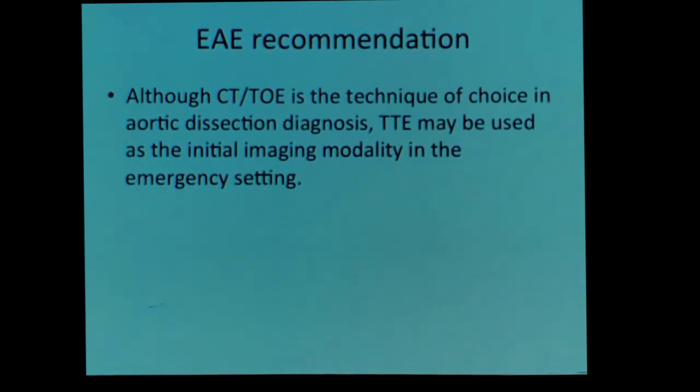So, although this is the European Association of Echo, and they seem to be more into transthoracic echo for dissection than Americans, they say, although CT or TEE is the technique of choice for aortic dissection diagnosis, transthoracic echo may be used as the initial imaging modality in the emergency setting. So I'll definitely try transthoracic on everybody that I suspect dissection.